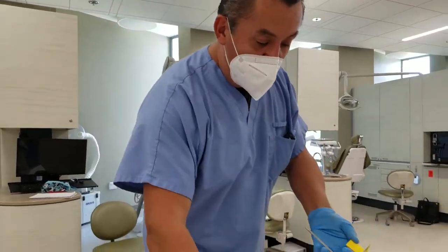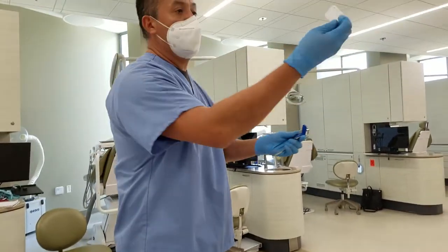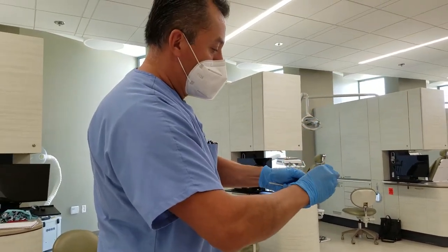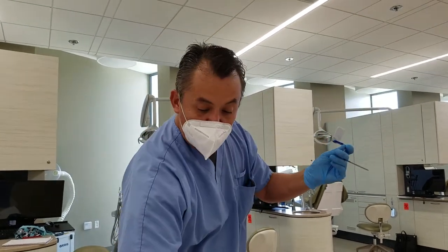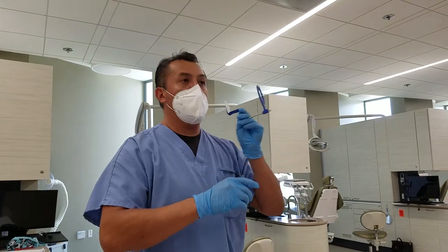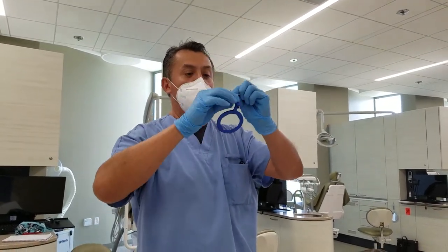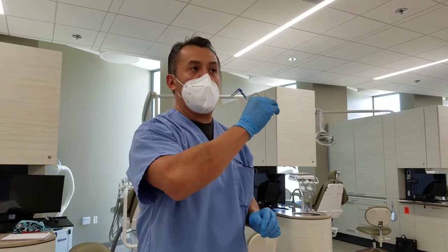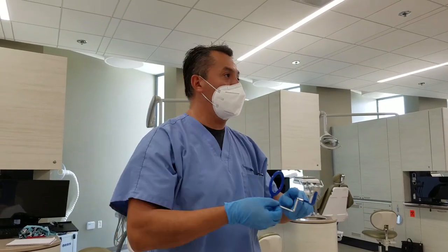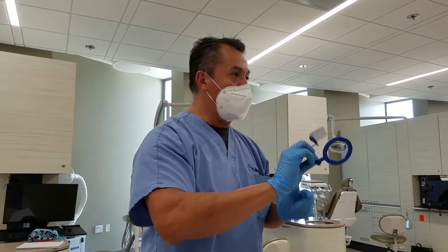Same thing for the anterior teeth — same principle. There is the dot, right there. Again, this is for upper: one, two, and three. For the lowers, you don't do anything, just flip it — one, two, and three. The dot towards the slot, or towards the bi-block. Very important that you do that.